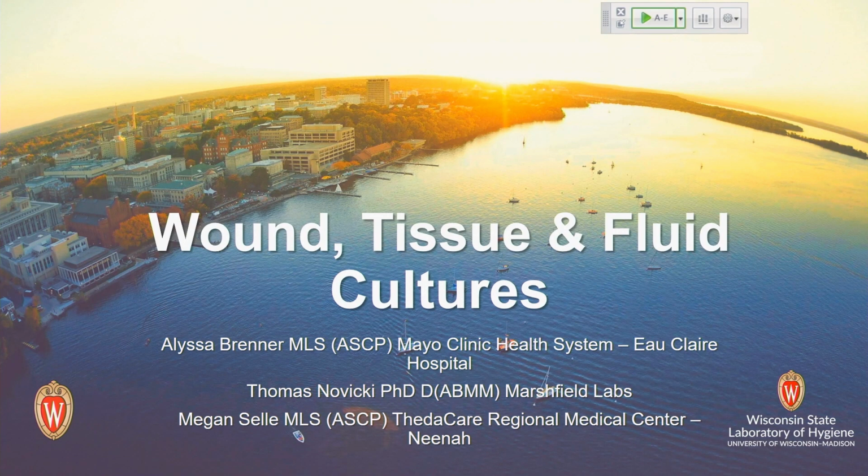We've already gotten our pathogen, so with anaerobes, most of the time treatment's the same anyway, so we don't really go down that rabbit hole. But it is on the same bench. Works very well for one tech to be reading both at the same time. Yeah. So I thought that was clinically significant. So we don't separate those.